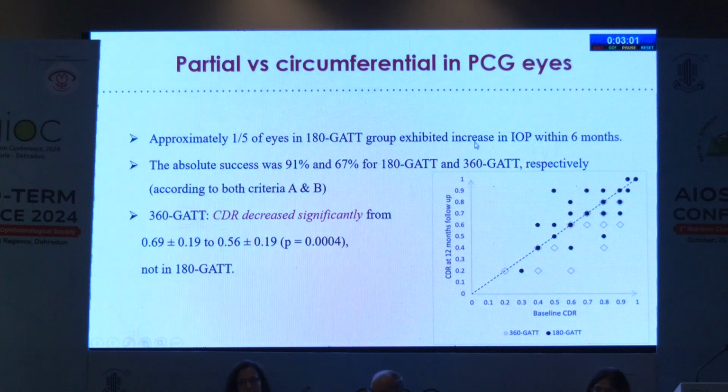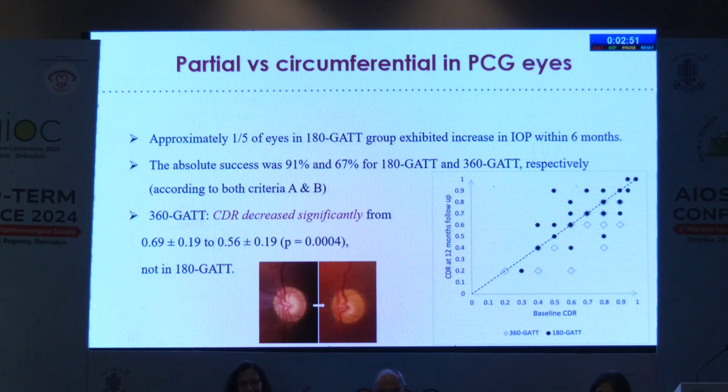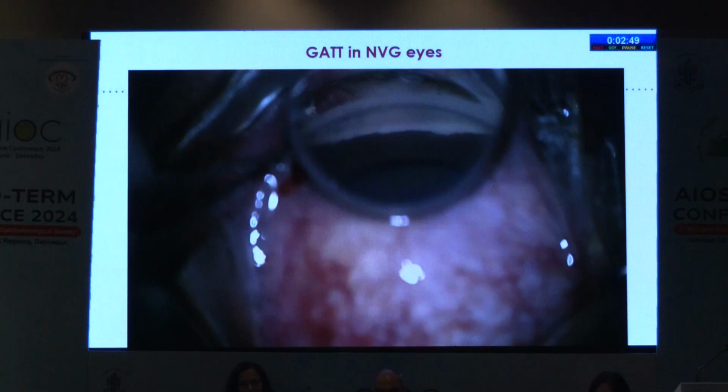Even when we looked at the CDR reversal, we found that the post-operative reversal was better with the 360 degree group compared to the 180 group, which did not experience reversal with the surgery. So this is one of the optic discs showing reversal post 360 degree GATT.